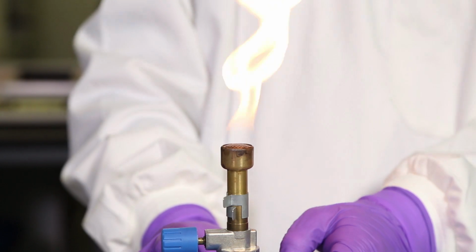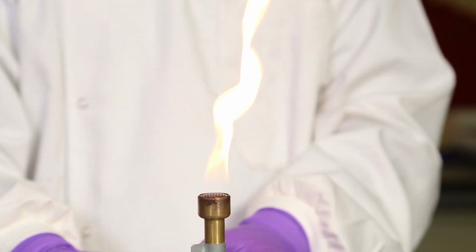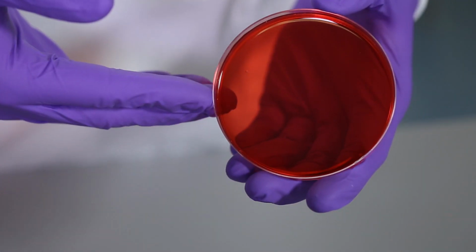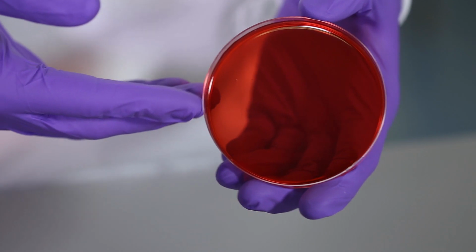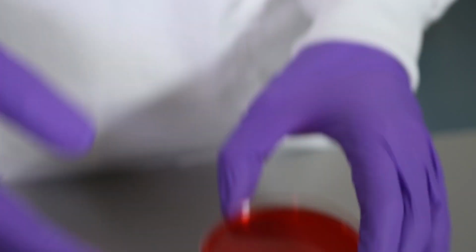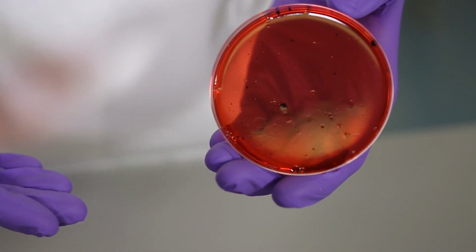A problem that can occur with agar plates is the presence of black or dark particles that are caused by burning culture media. Here is xylose-lysine deoxycholate agar, or XLD, for the detection of salmonella. If prepared correctly, the agar is a clear red gel. You can see here that there are black particles throughout the agar.